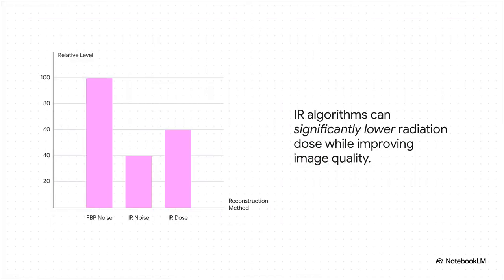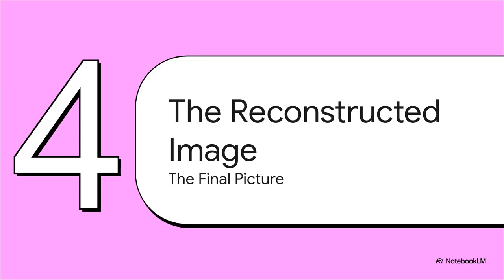So why use this more complex method? This chart explains it perfectly. Iterative reconstruction produces clearer images with significantly less noise. And the most important benefit? It can do this while using a much lower radiation dose to the patient. That's a huge win.